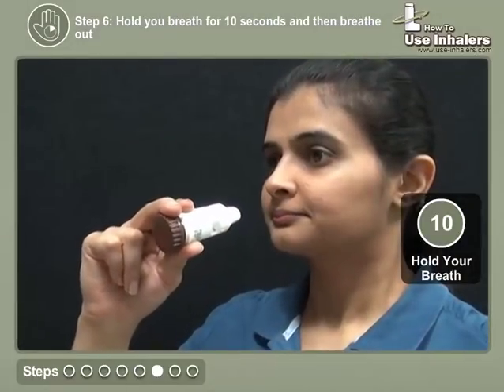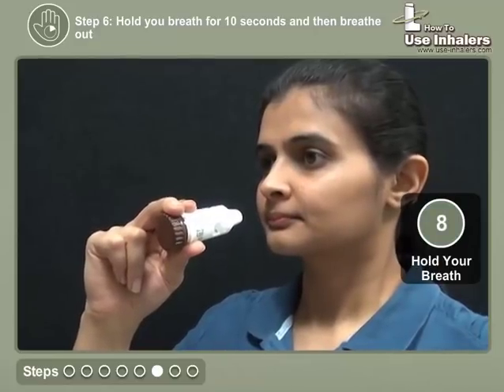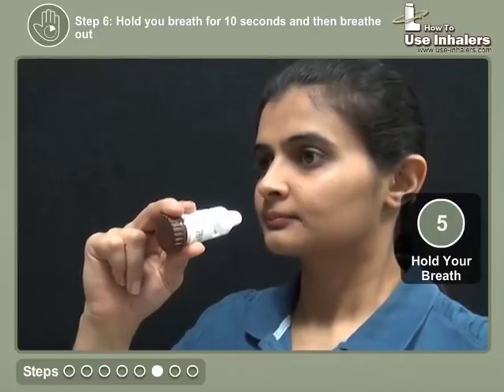Remove the mouthpiece, hold your breath for 10 seconds or as long as you are comfortable, and breathe out slowly through mouth or nose.